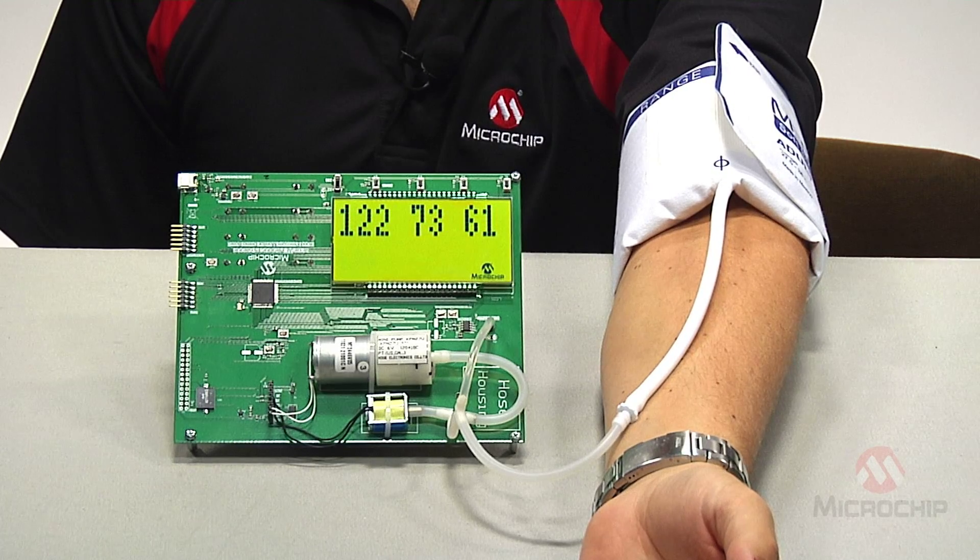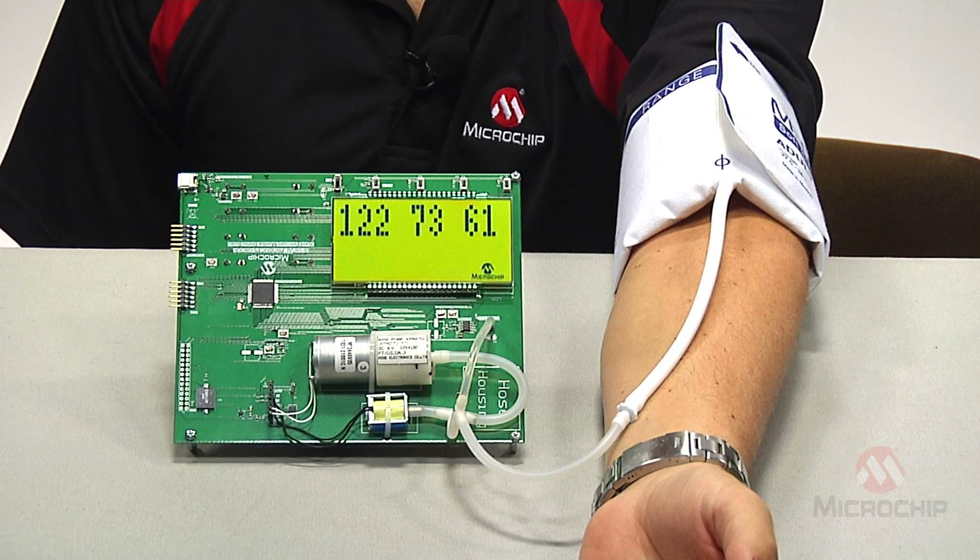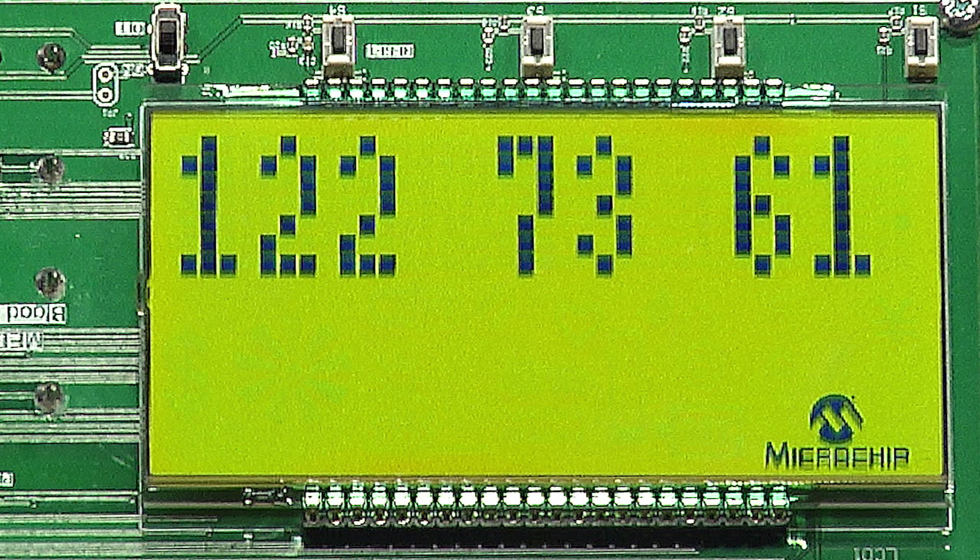The GC is now calculating my blood pressure and I'm all done. My reading is 122 over 73 and a pulse of 61. Lucky for me, that's a normal reading. So there you have it — the PIC24F GC family's intelligent analog powers this blood pressure meter reference design and it can power yours too.